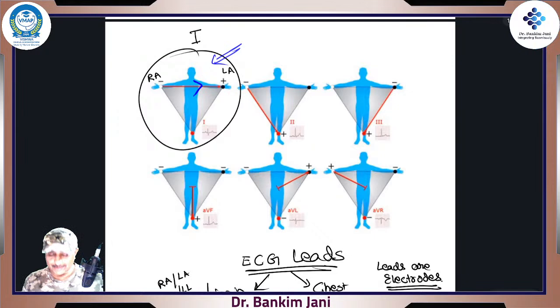Because this is the beauty of electronics, right? This is the beauty of electronics, that things move so quickly and so effectively by the use of those integrated circuits, that we actually get the complete picture without even changing those electrodes. Because yes, you are right, one electrode cannot be positive and negative both. Yeah. So over here, from the medical student perspective, no one is going to ask this question, but just for the sake of curiosity, it is good to know, right? That is what is called the rapid switching.